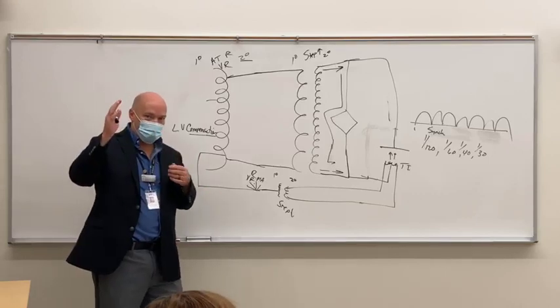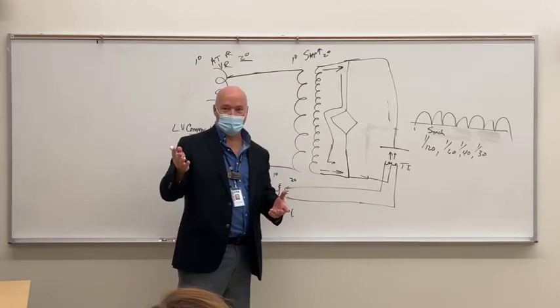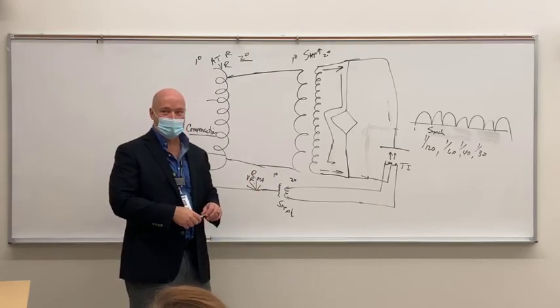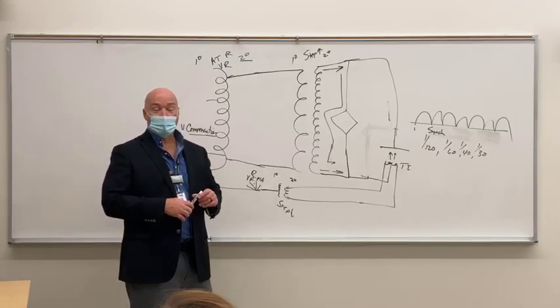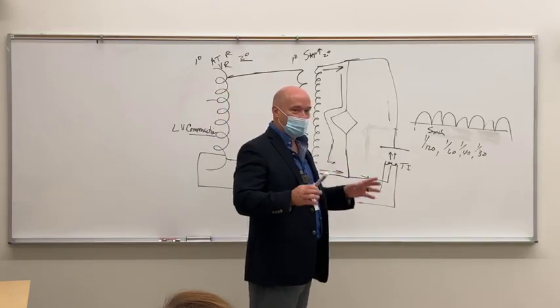So how many of y'all, and I know what the answer to this is, every one of you should raise your hands to this. How many of y'all have set a technique in your phototiming and the tech comes in and adjusts the kVp just a little? Every single one. You're going to do the same thing because you're going to get it in your mind that you've got to touch it.